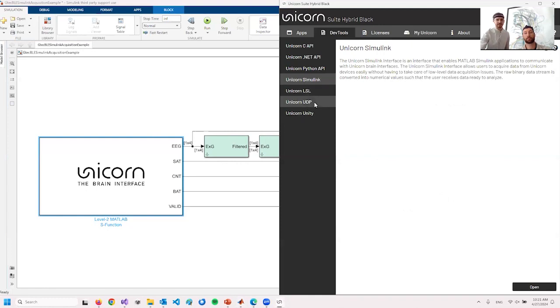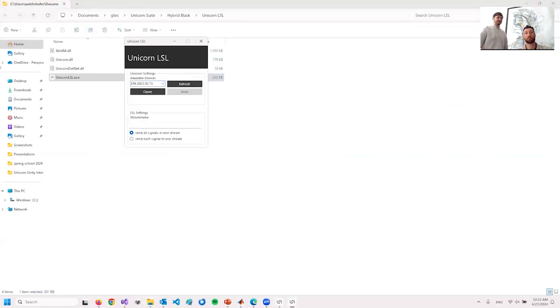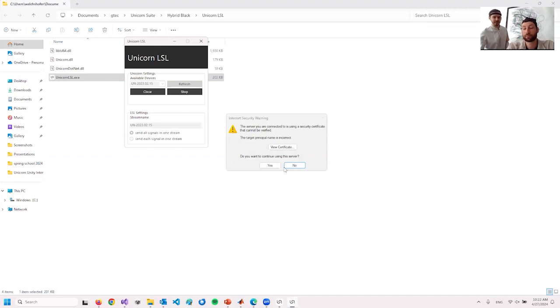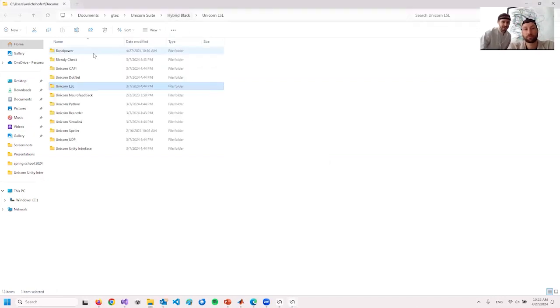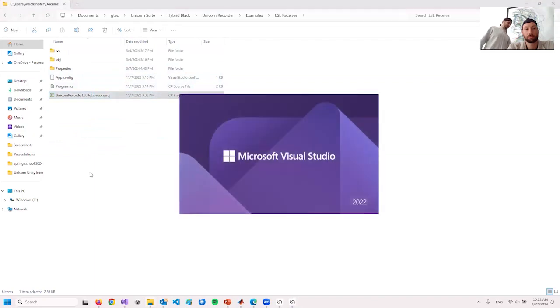Then we have the Lab Streaming Layer and the UDP interfaces. They are also programming interfaces, but with a small GUI. For Lab Streaming Layer, we have a very simple GUI that sends all your signals from the Unicorn to Lab Streaming Layer. Lab Streaming Layer is a standardized network protocol, so if you're sending data via Lab Streaming Layer, you can receive it in another application. I've also added a receiving example on our GitHub, or there's also one installed with the recorder. Maybe I can also show that shortly.